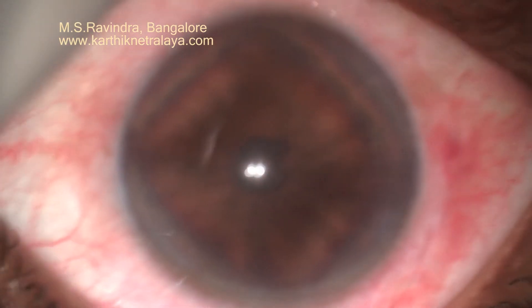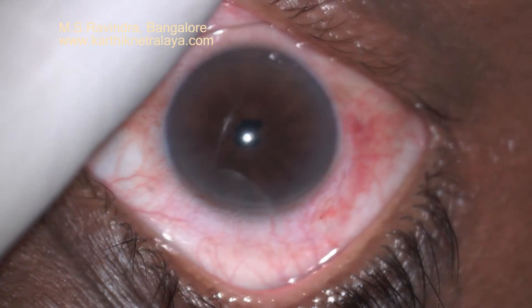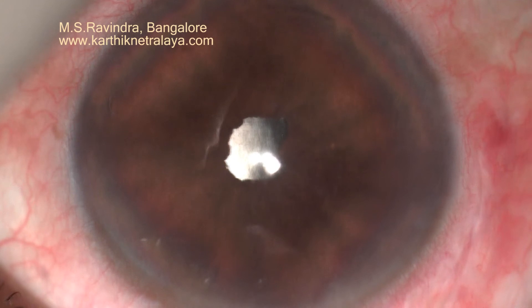This is the other eye done a few days ago — it is absolutely clear and the pupil is round. I do not keep them under homatropine. Whenever the patient comes, I dilate it and let it go so that the pupil does not synechiate again.